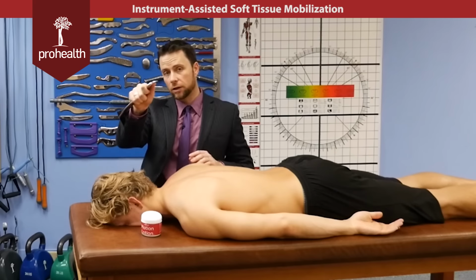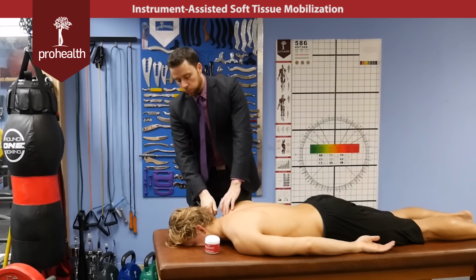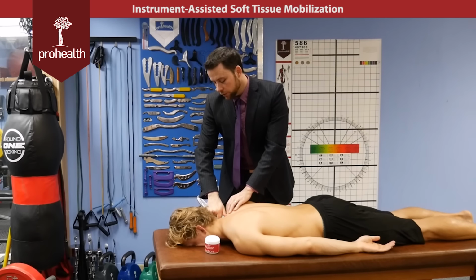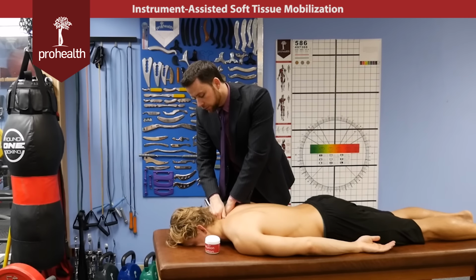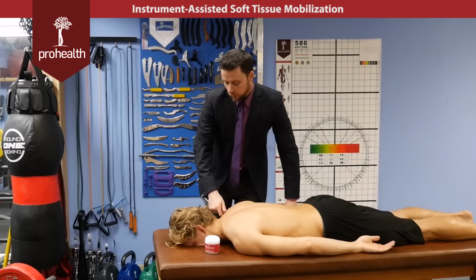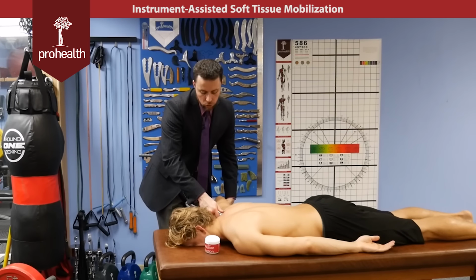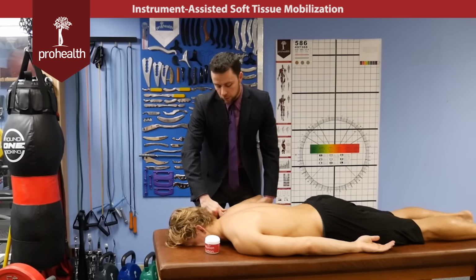And if I wanted to get even more specific than that, I can use this instrument like it's my extra thumb, where I can push into it and I have a grip through my entire hand, and we could separate through the different tissues and start to sink in and just really work your way through it. Or maybe even doing it with a little bit of pinning and stretching, or if you were doing maybe more of a supraspinatus type issue, you could take the arm up like this a little bit, shorten supraspinatus, hook in, and then take him through a little bit of a lengthening action.